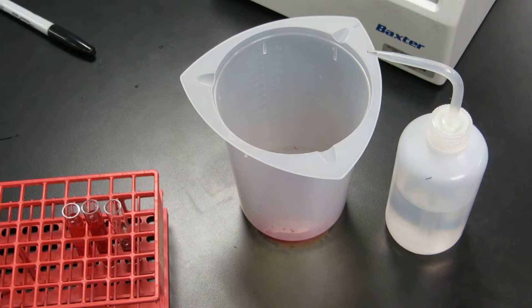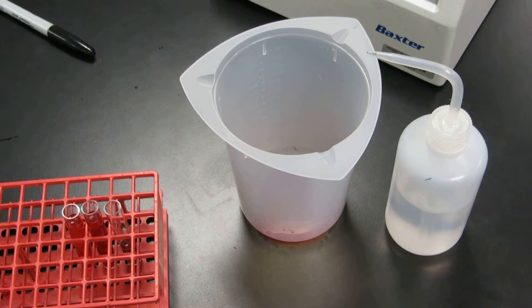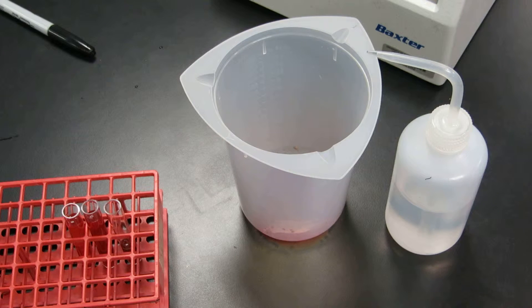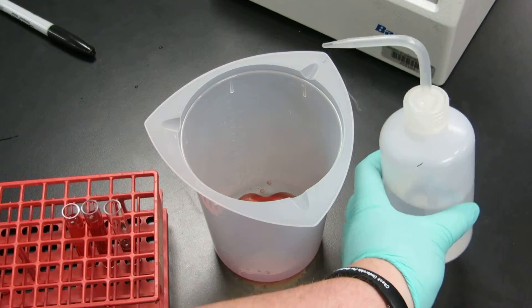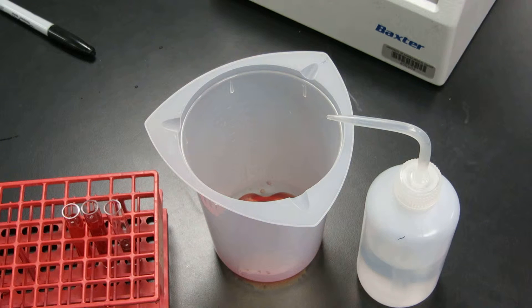The first thing I'd like to show you is what it means to wash a 12 by 75 tube. You might think that this is simple for both tubes, but they are slightly different due to their size differences. So you will need a waste bucket, a saline bottle with your name on it, as well as a centrifuge.